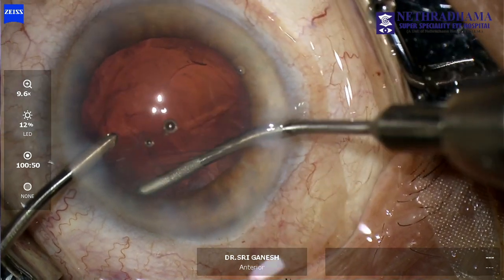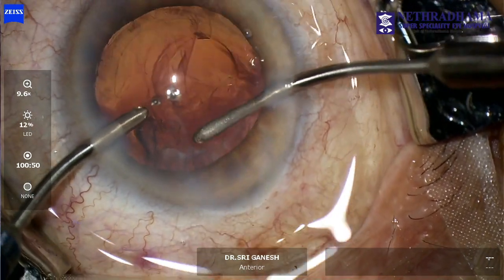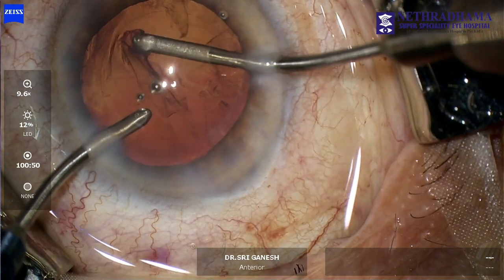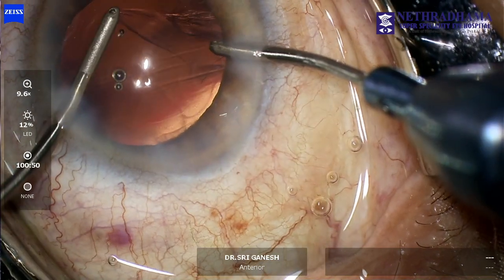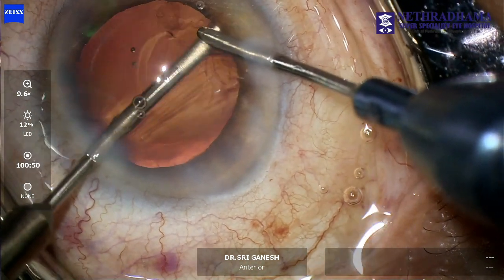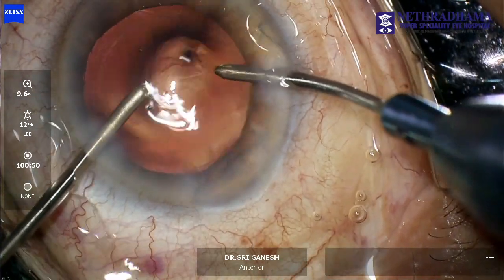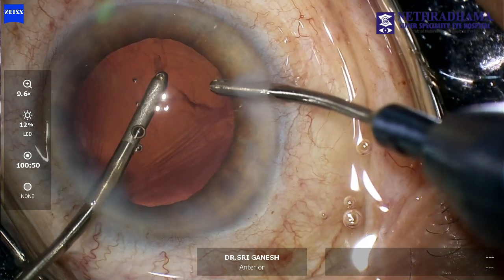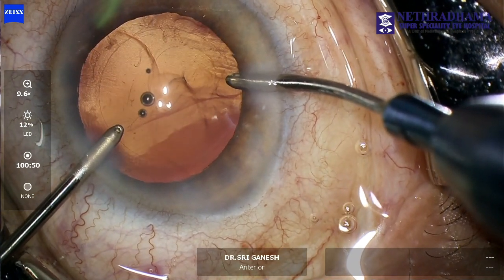A bimanual IA is more controlled in such situations — you just keep the irrigation cannula in the AC without taking it deeper and then strip the cortex very carefully. You can see that it is very easy to reach into the capsular fornix with the bimanual IA and strip out the cortex. Note that the blob of viscoelastic near the PCR is not disturbed, because of the very gentle irrigation aspiration. With the bimanual IA, you are not hydrating the vitreous. This is the last part of the cortex being removed and you can see there is no distortion of the PCR margins, showing there is no vitreous prolapse.